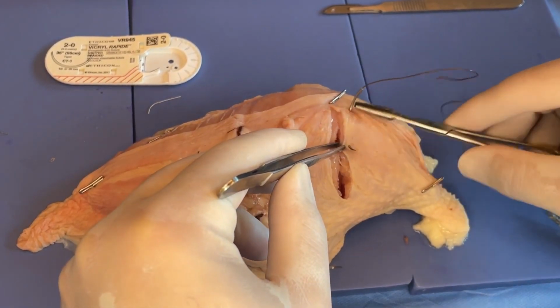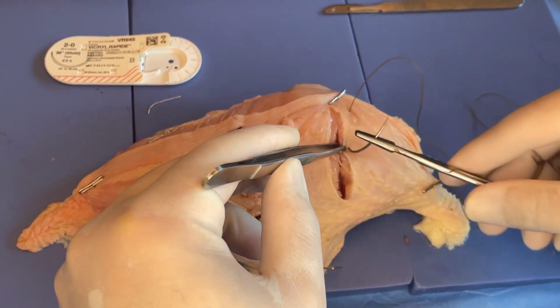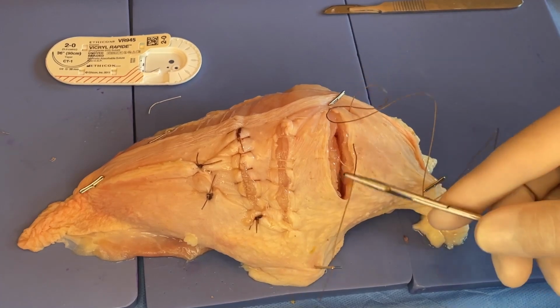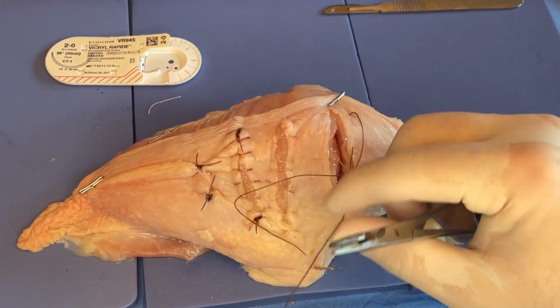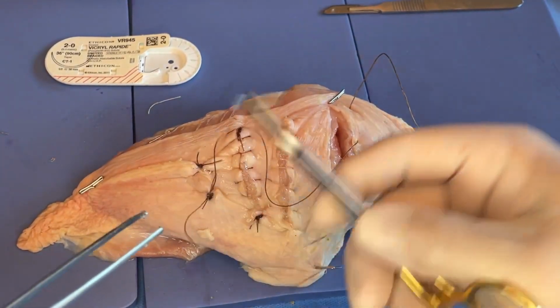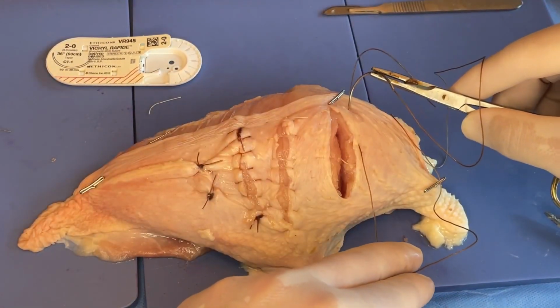This is our CTX needle, so it's quite large. So there. We haven't actually gone into the defect itself. We'll pull that through. Chromic's getting a little dry, so it's a little bit harder to pull through the tissue here. All right, and then we go over to the other side of our defect, and we don't repeat this bite.